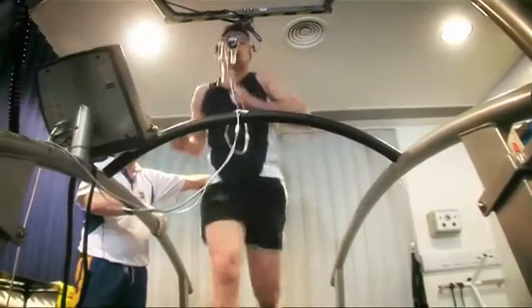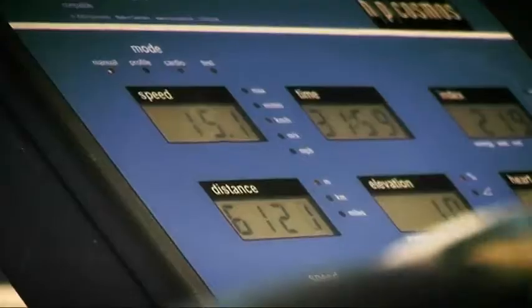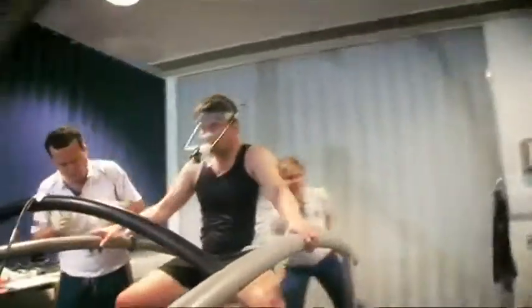The test should take around about 20 minutes — that's what we aim for. It will vary depending on the fitness of the athlete. The way it works is that it's an incremental step test, going up gradually and progressively getting harder up to the point where the athlete says they can't do any more, and we stop the test there.